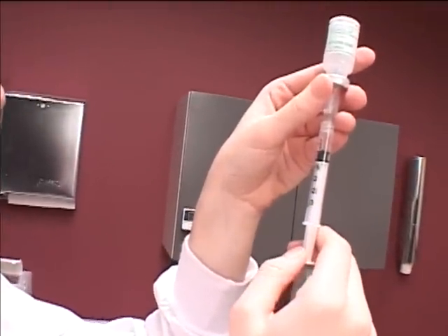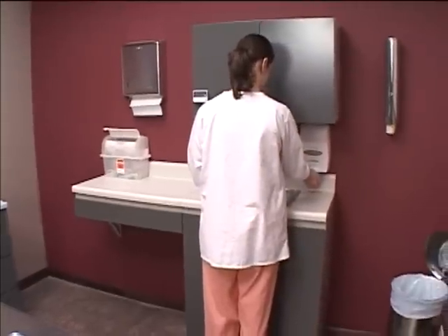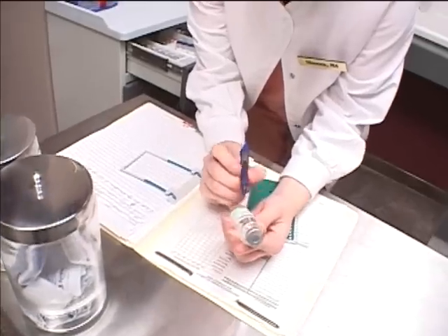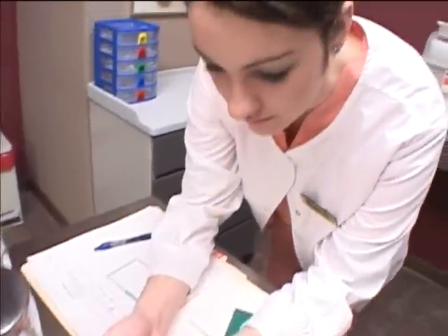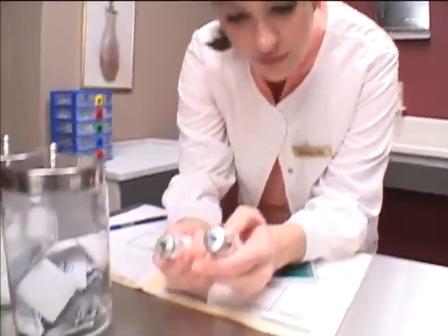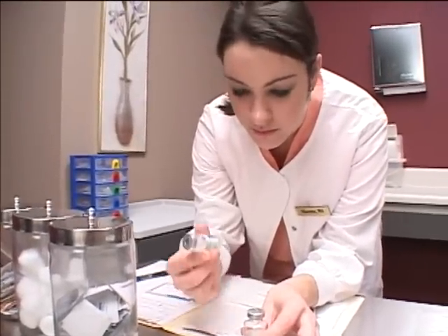When drawing up medication from 2 vials for administration, you should begin by washing your hands. Then, select the appropriate vials and prevent error by verifying them against the physician's order for the 6 rights. Determine the route the medication will be delivered to ascertain what size syringe and needle will be needed. Determine the order that the medications will be drawn into the syringe.